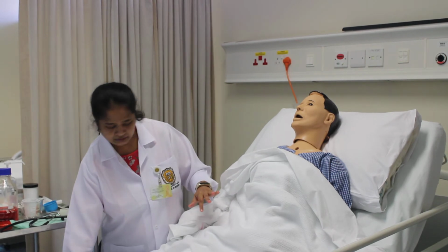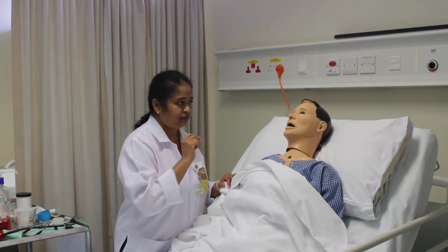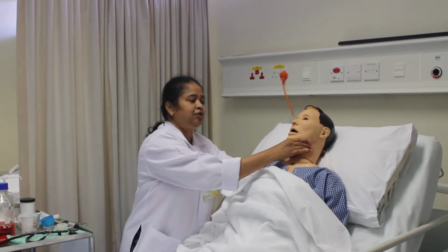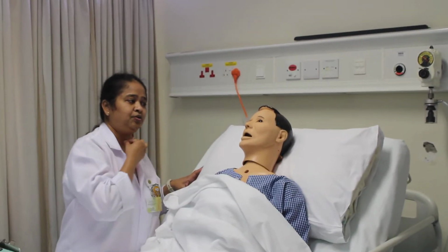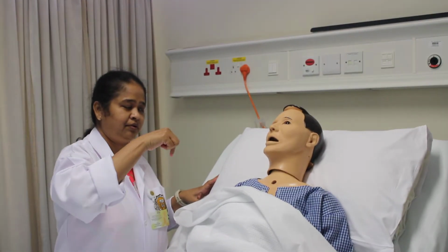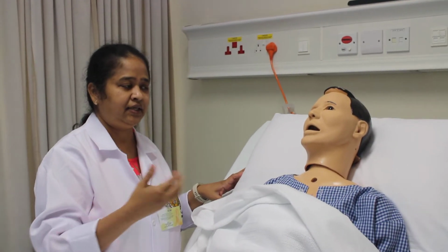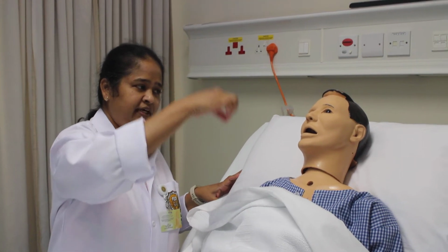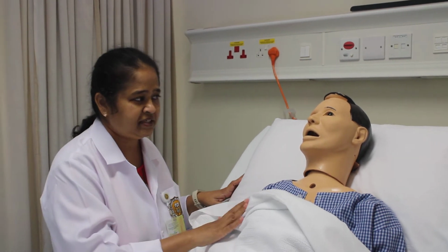Okay. Sir, now when I am going to put the tube, first you will have to hyperextend your neck, like this, till I reach the throat. After I reach your throat, you will have to flex your neck and swallow. Then it is easy for us to facilitate the tube into your stomach. So these two instructions please remember.